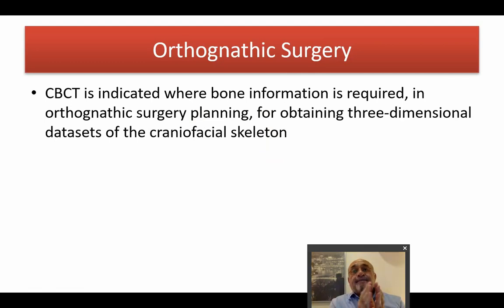Then it is justifiable that you are recommended to go for a 3D CBCT examination so that you will have a full understanding of the area.